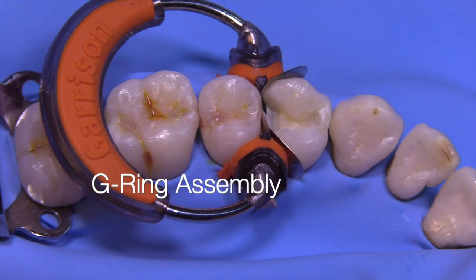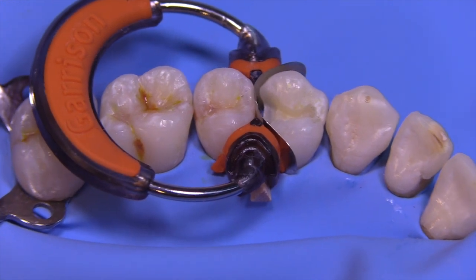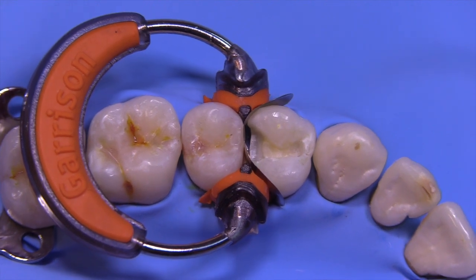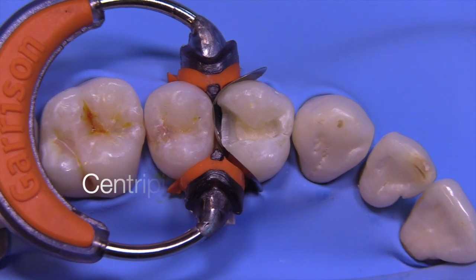This is the entire assembly, and you'll notice that I've put the ring towards the distal so that I'll have plenty of room to work in the box area. The ring will only be on for a short period of time. We're going to take this class two and do something called the centripetal wall technique.